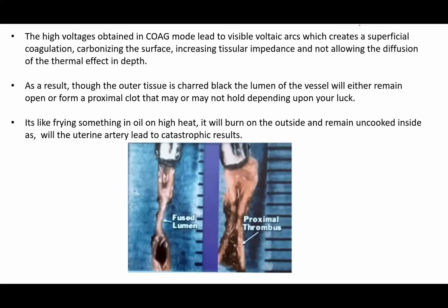Now, this image here is very important. It is very important you know how the bipolar causes hemostasis. One, it coapts the tissue.